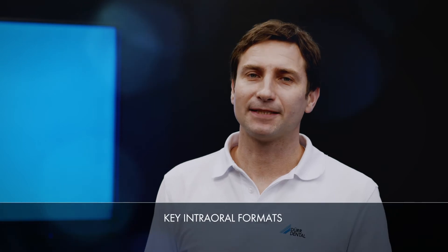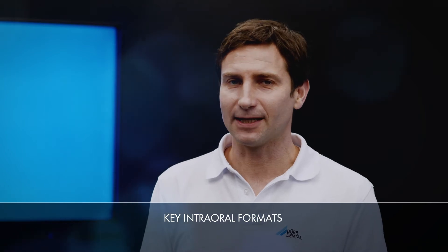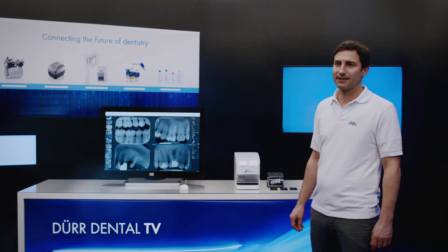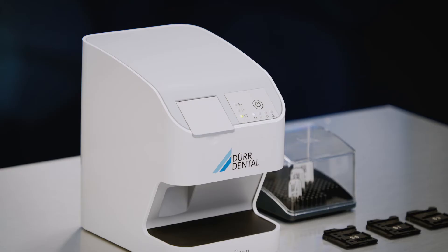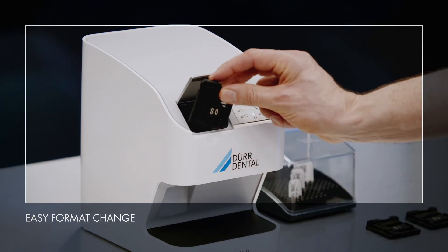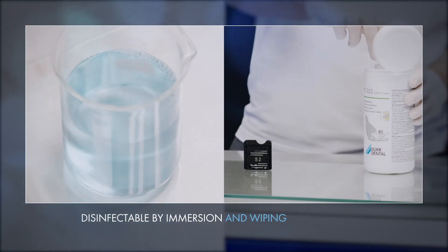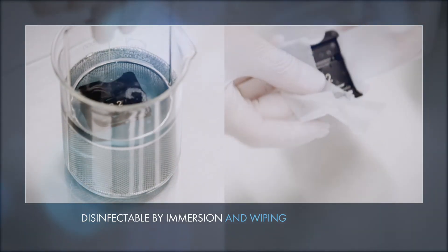With VistaScan NanoEasy, all the most important intraoral image plate sizes can be scanned: S0, S1 and S2. If you want to first scan an S2 image plate followed by an image plate with the size S0, all you need to do is change the cartridge. Hygiene is an incredibly important issue for DoorDental. This is why the infeed unit and the cartridges of VistaScan NanoEasy are very easy to clean.